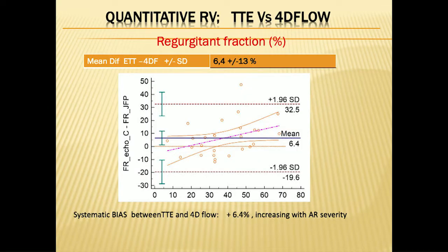Now the Bland and Altman analysis also provides important information, and it was already found in different publications. The tendency of MR to underestimate flow compared to TTE, but of course I will finish by saying that it is TTE which overestimates flow compared to MRI, because we have some good clues to make this assertion.